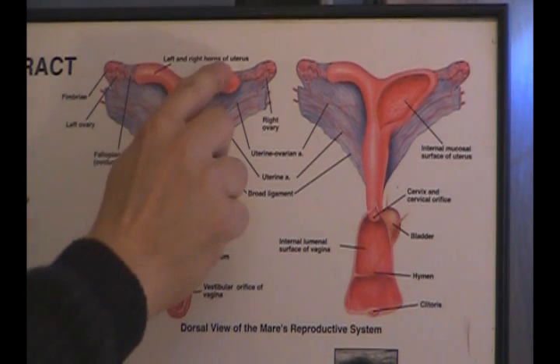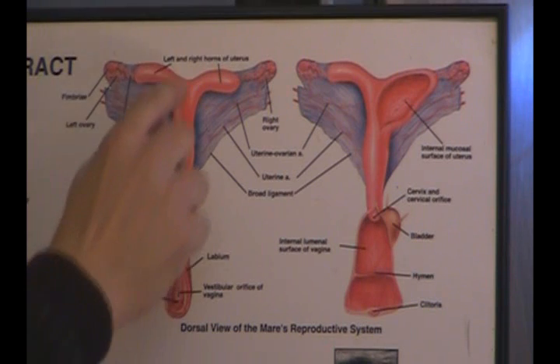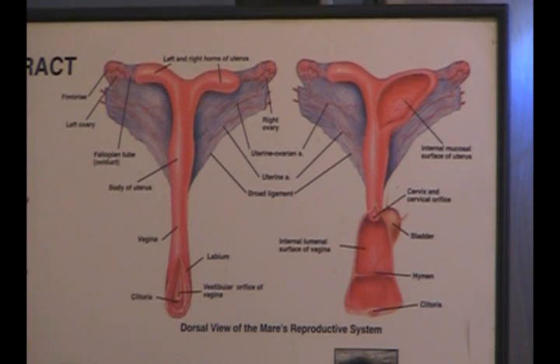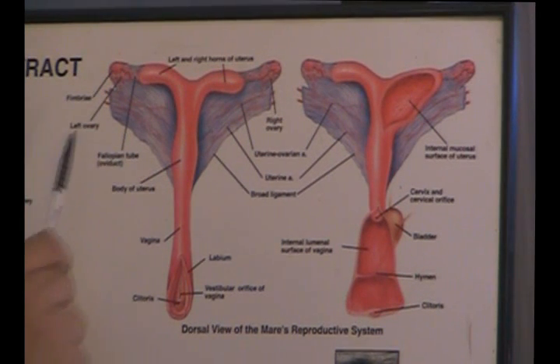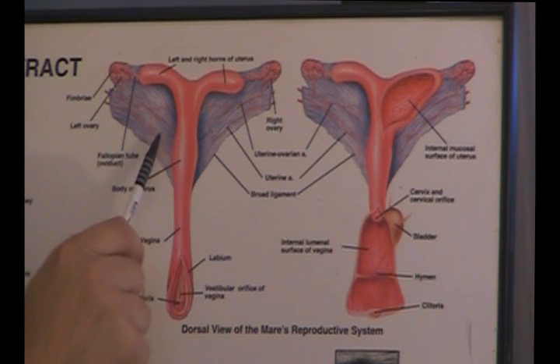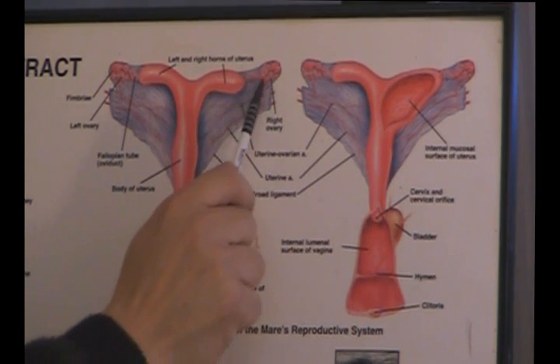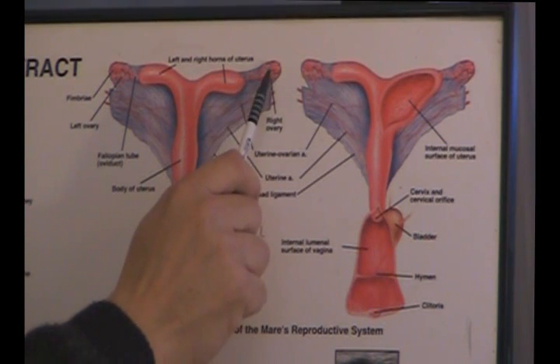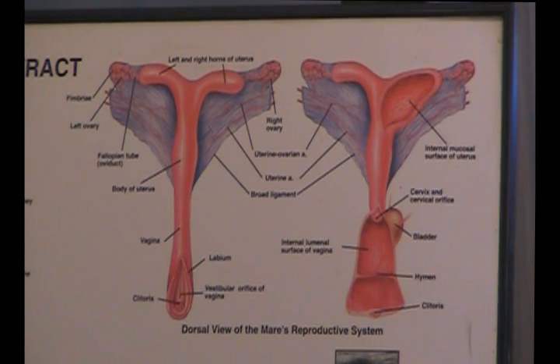The uterine horns in this diagram are shown in a T position, but oftentimes the uterine horns are rotated upward in a Y position, which will become important when we talk about scanning for ovaries. Recall that the reproductive tract is suspended by the broad ligament and sits loosely on top of the digestive system. Also, the oviduct is not seen by ultrasound, and the ovary is located a short distance from the tip of the uterine horn. These two anatomical features often make it challenging to find the ovaries.